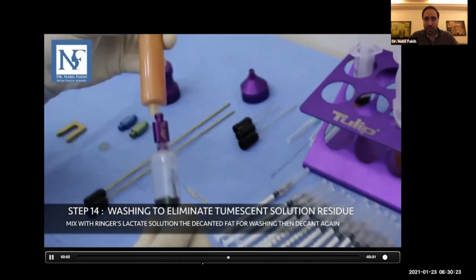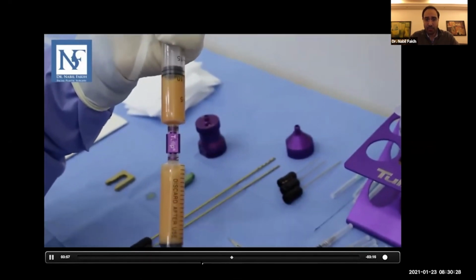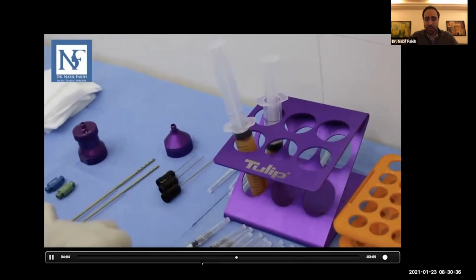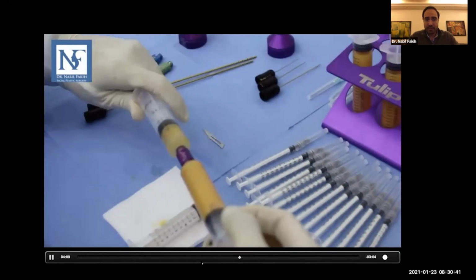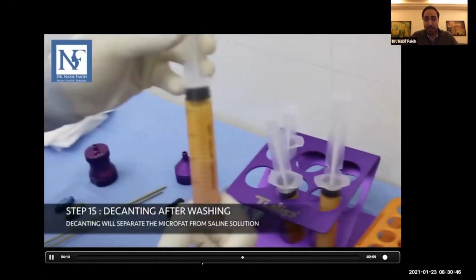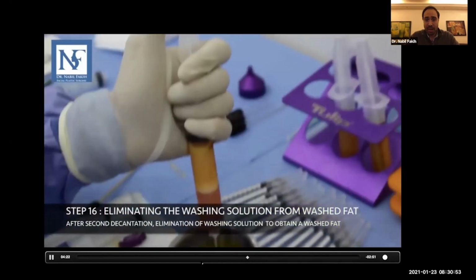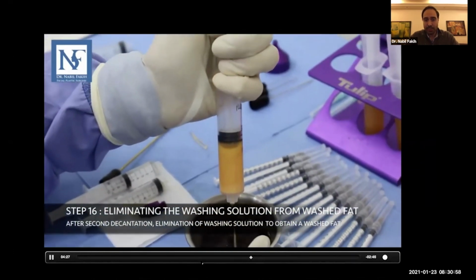After this, what I'm doing exactly is to pass it to ringer lactate to clean the microfat. So we pass it to ringer lactate, 50% ringer lactate, 50% microfat, and we do with the other syringes the same thing. Okay. So remember that I'm preparing nanofat only. If I'm preparing microfat, I don't use this transporter that you have seen. I'll be using the decanter transporter. I'm using this transporter, reducing the fat size, but no worries, because I'm planning to do nanofat.